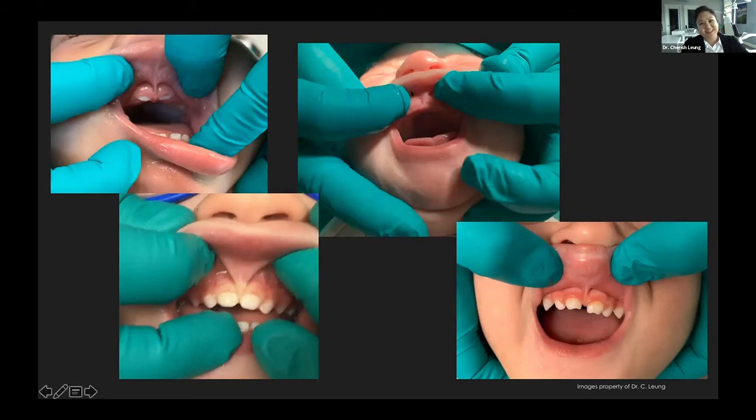Another one here, really thick and tight. That one was super thick. A lot of times you'll see it like this. Really wide V, wide insertion there. All of this blanching between these two teeth here. Really strong indicators of a lip tie that can be treated. Even though he doesn't have a diastema, it was trapping so much food.